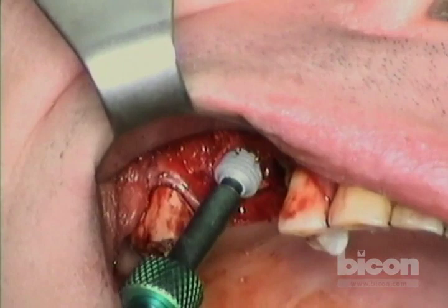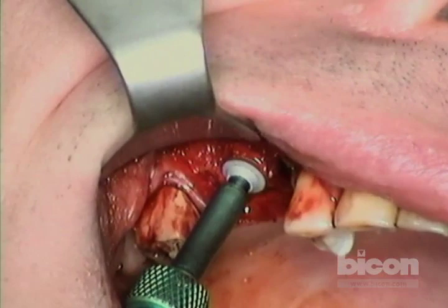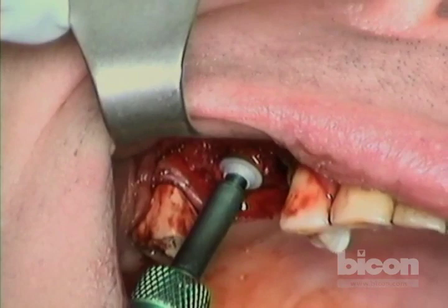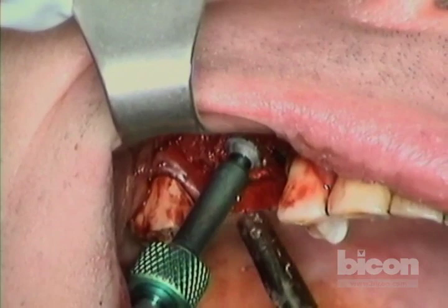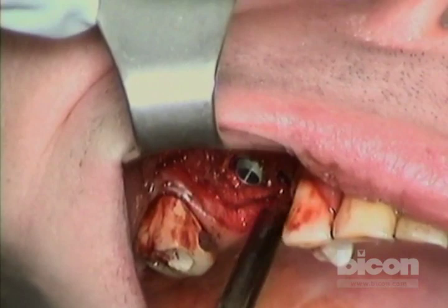We're placing our second implant — using a slight twisting motion to escape the edges of the rectangle, then tapping it the rest of the way in. Arthur confirms he can feel it in his nose.